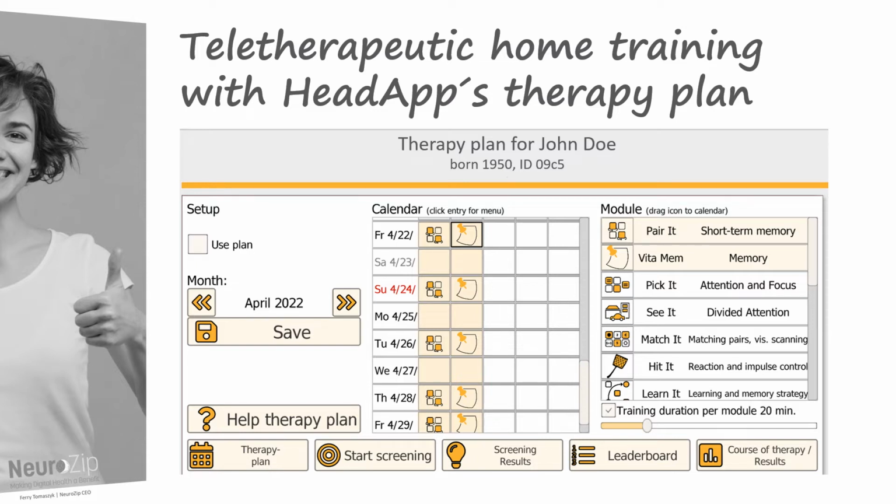Completed screening and training results are then available in real time on the clinician's computer for monitoring and therapeutic evaluation. It's made so simple. The only thing you need is any computer, laptop, or tablet and an internet connection. HeadApp's GDPR and HIPAA compliance guarantees data privacy.